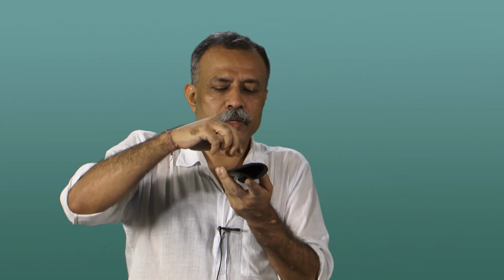It is almost like the people who are holding hands have a weaker holding, but the newer ones coming of your choice have a stronger anchor. So they will hold it tightly and they will dismantle them from the site. And this is what we call the competition. There's a competition between the molecules to bind to the target. And this is the fundamental basis of LFIA's competitive assay.